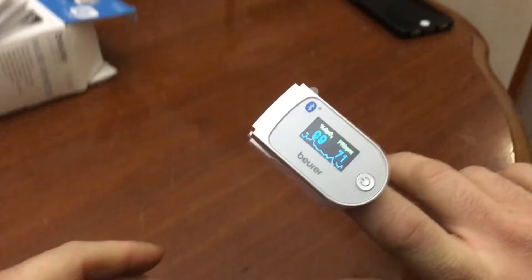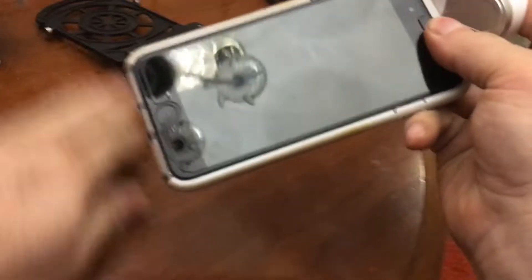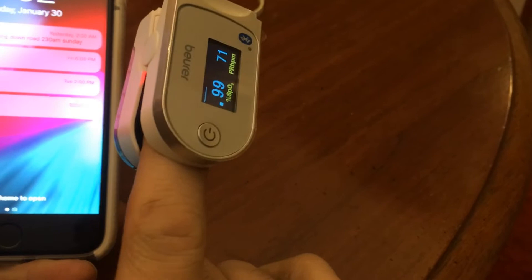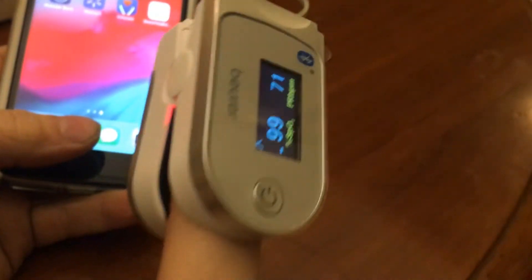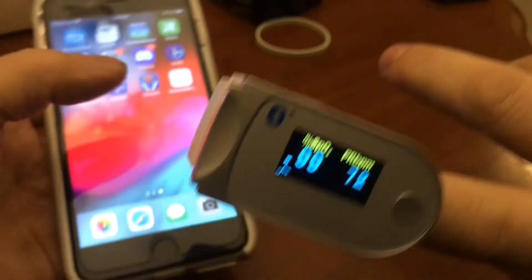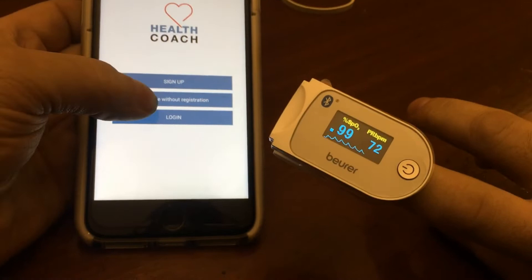All right, let's see if the app works. We're not dead — lose my finger... oh, cool! The other one definitely doesn't do that. That's pretty cool — that is really cool. That's a true digital display. All right, let's see what Health Coach does.